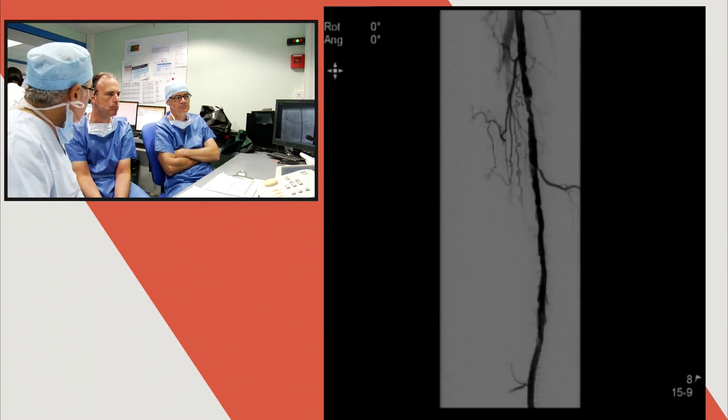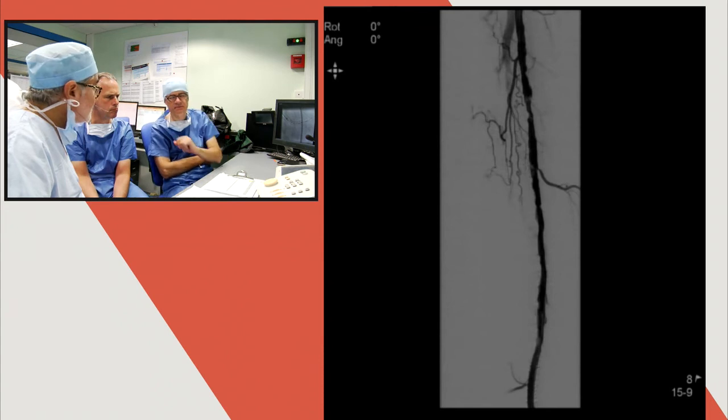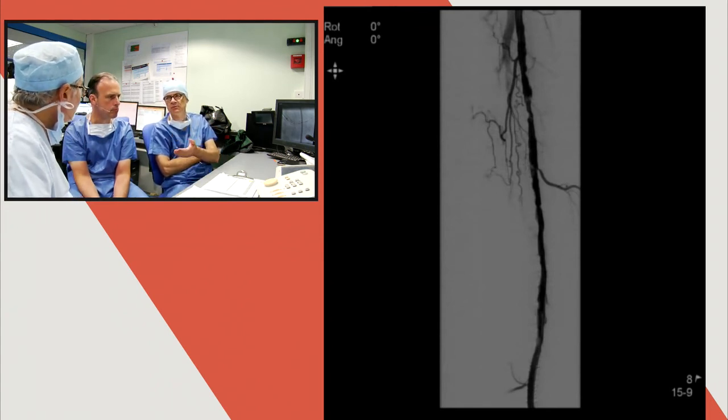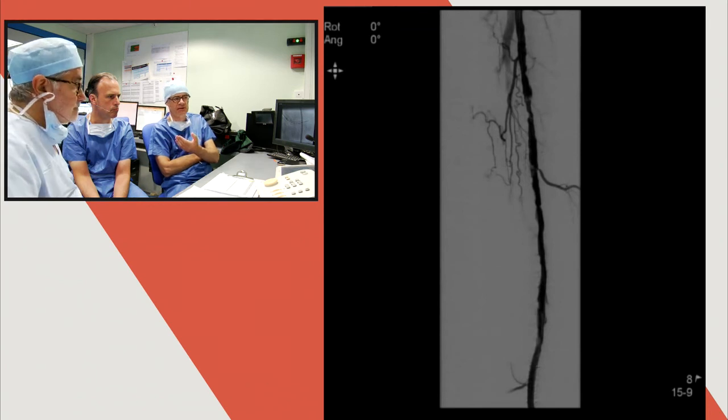So we decided anyway, after discussion, to stent, and the discussion was, do we stent from this area, exactly at the position of a stent, or do we respect this zone? And Thomas, we defended respecting this zone. Yes, because this area was not severely diseased initially, so it does not really need a scaffolding, and a stent is not really indicated.